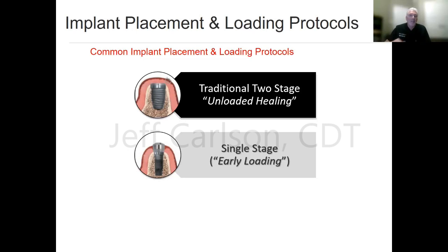So the top of the abutment is actually exposed to the oral environment, so that the implant is getting stimulated, not from occlusion necessarily, but through the patient biting on a bolus of food. Maybe you have a temporary prosthesis over it, but it is being loaded.